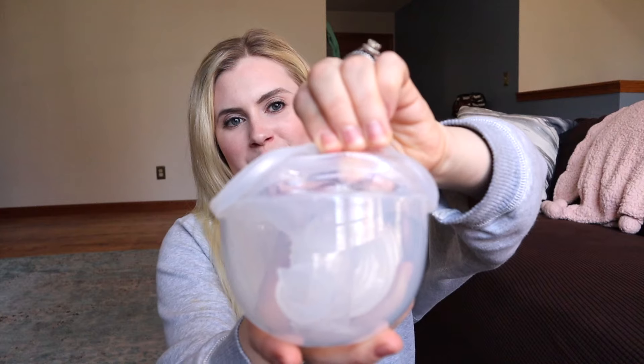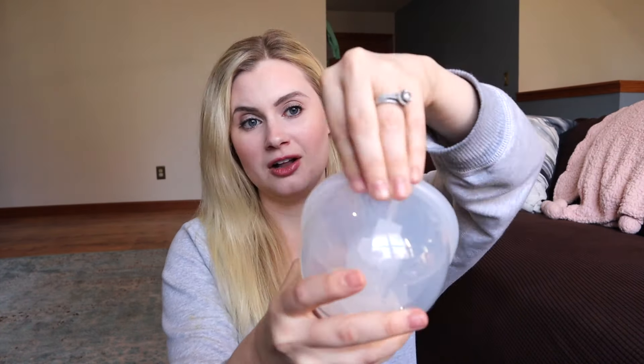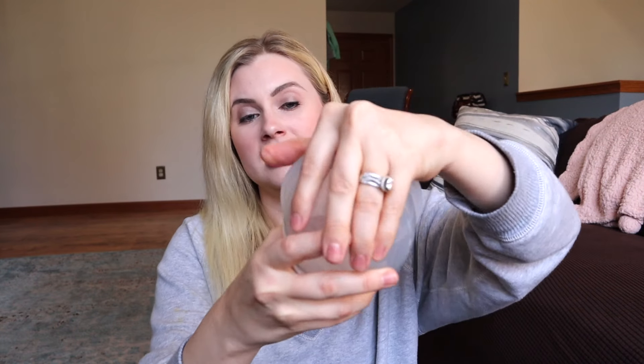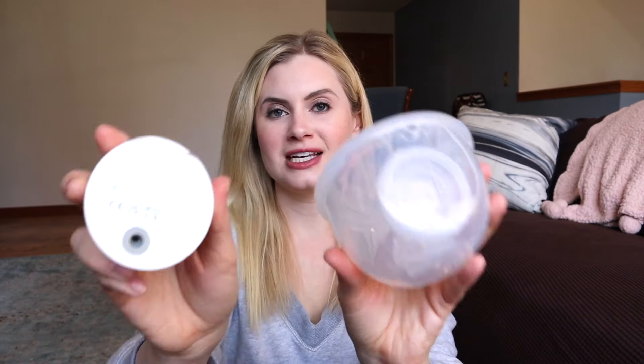The flanges are double-sealed, so you are not going to have leaking problems — I haven't had any at all, and I haven't heard about anybody who has. The top is different too: on the original version it's sealed to the motor using a silicone ring, which people had issues with — milk would get under it, it would wear out, you had to replace it. On this one it just snaps on using one hole, and it makes a click when it snaps on, so you know when it's secure.